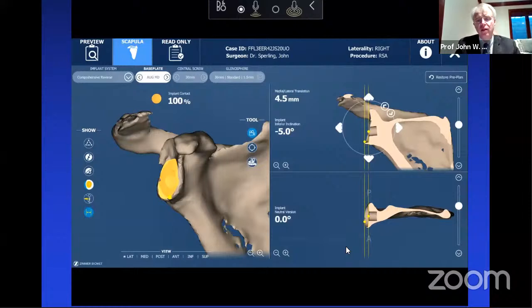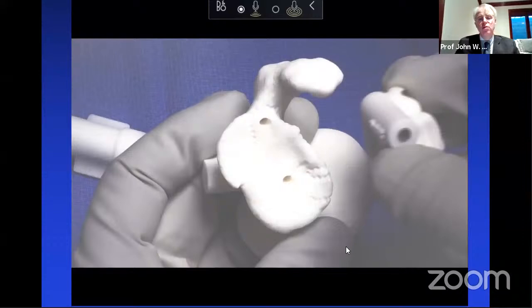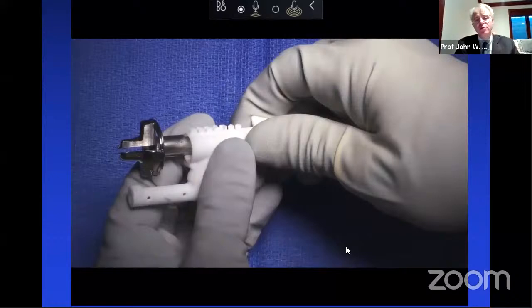A hot topic in the US now also is quality of planning, ensuring that the plan we come up with is what we actually want. So this is an example of the intraoperative guide. And what we'll do now is with this guide, we'll have depth control. So I can preoperative plan exactly how much bone I want to remove and how deep. And there's going to be a guide we'll place on the reamer. So this is all planned out ahead of time.